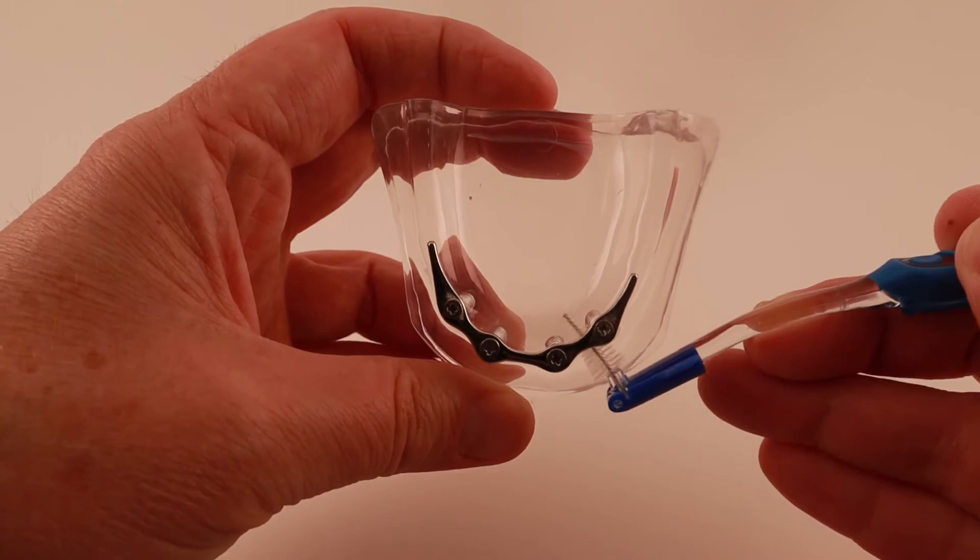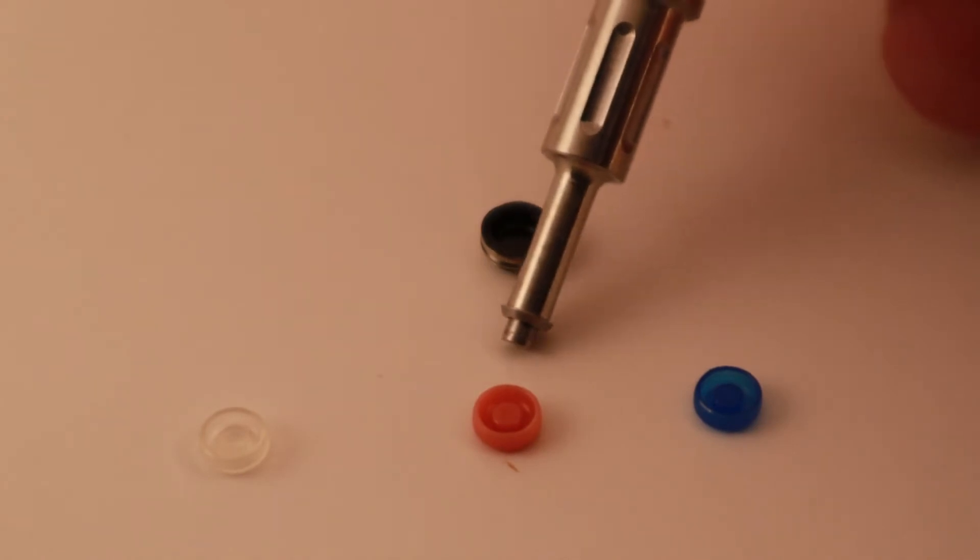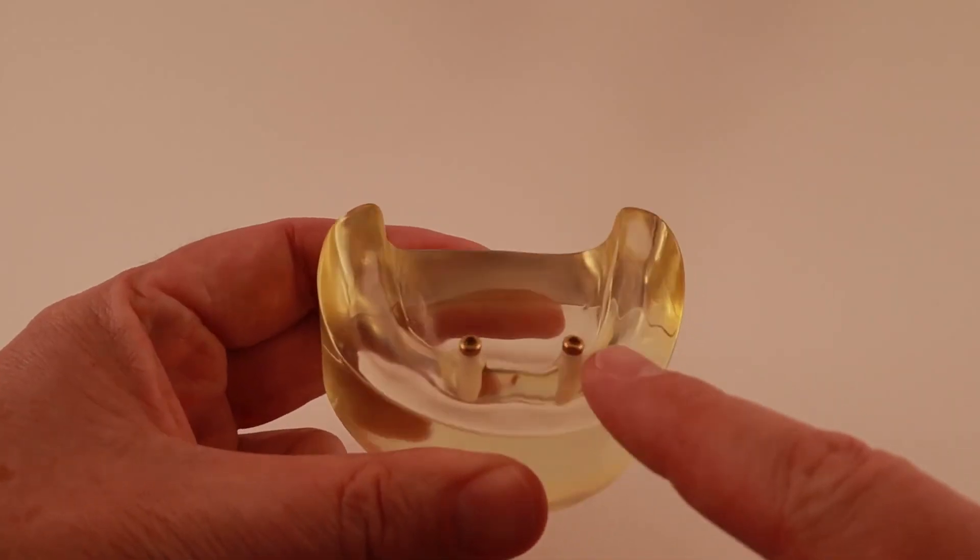The implant retained overdenture transmits biting force to your gums like a regular denture does, so you won't be able to bite with as much force. You can chew much better than with a regular denture, but there will always be a little give. The overdenture also needs to be big enough to transfer the biting forces to your gums. For an upper overdenture, the roof of the mouth part can be removed, but it can't be made as small as an implant supported overdenture. On the plus side, since the implants are only holding the denture in, you don't need as many — especially in your lower jaw. Most times two implants are enough to make a huge difference. Also, because the posts and snaps are fairly small, you most likely won't need to have your jawbone shaved down.